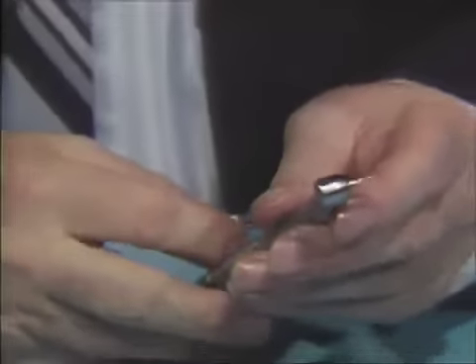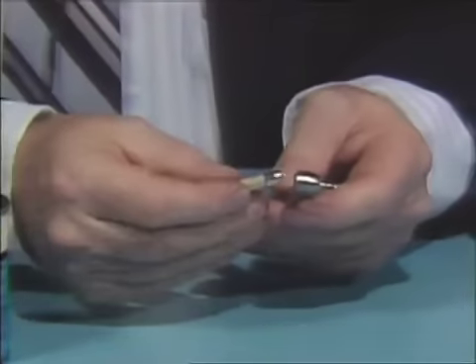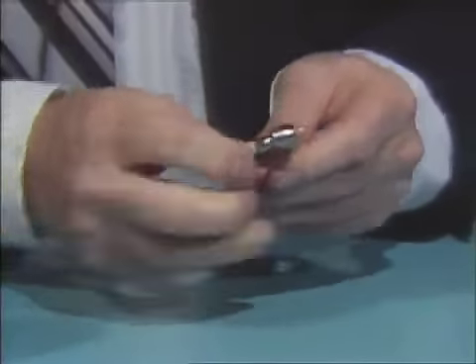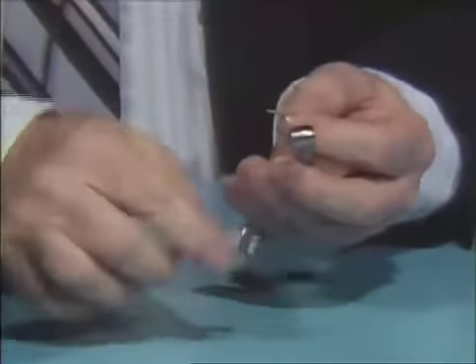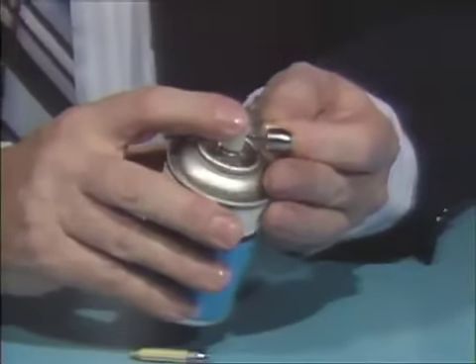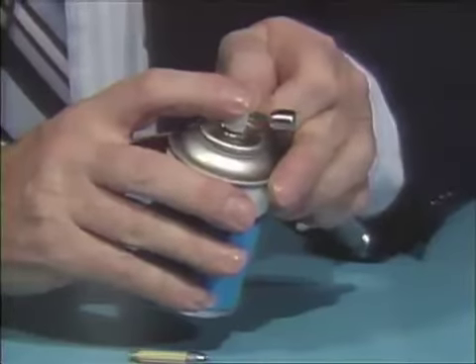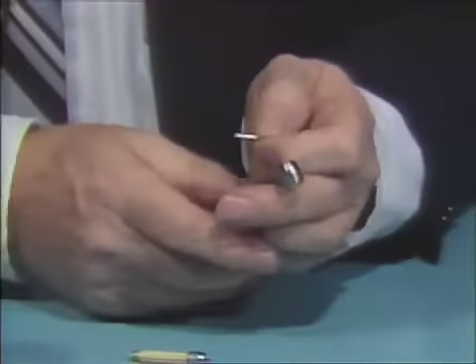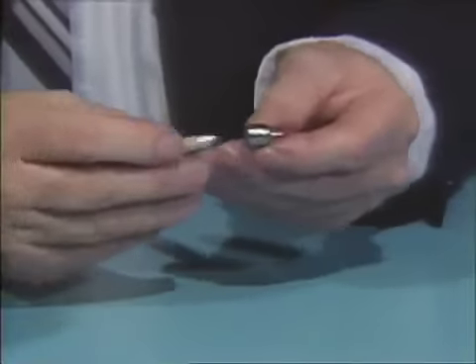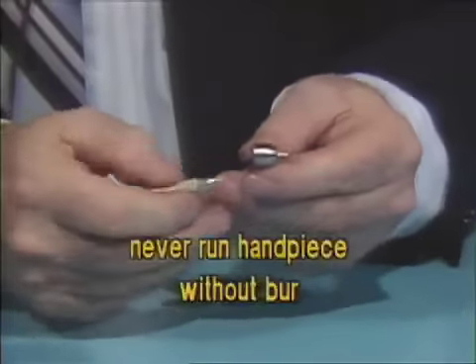Then run the handpiece. Once a week, you should remove the burr and clean the chuck by applying Spray-A-Day from both the cap portion and the front portion. Never — and I stress that point — never run the handpiece without a burr in it.